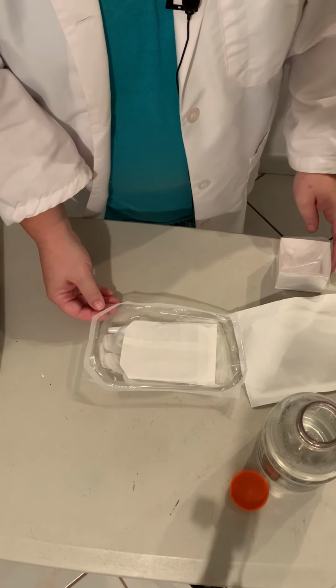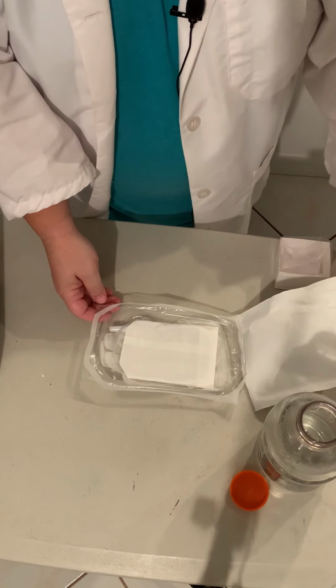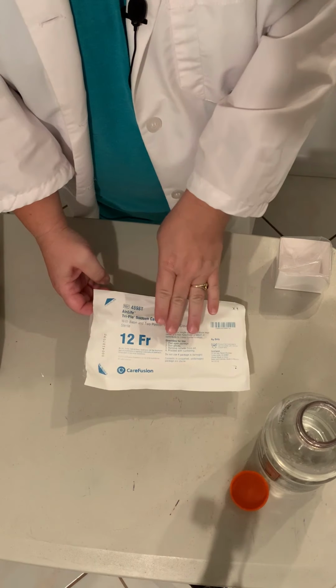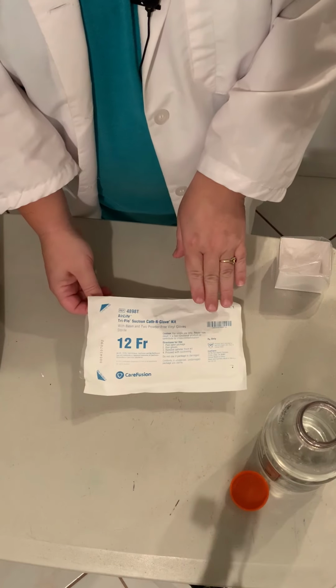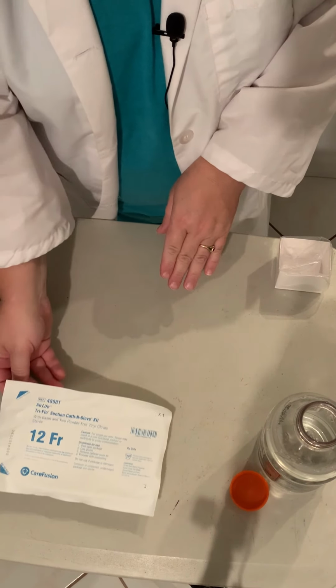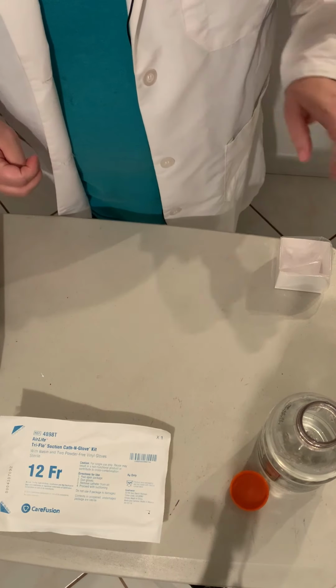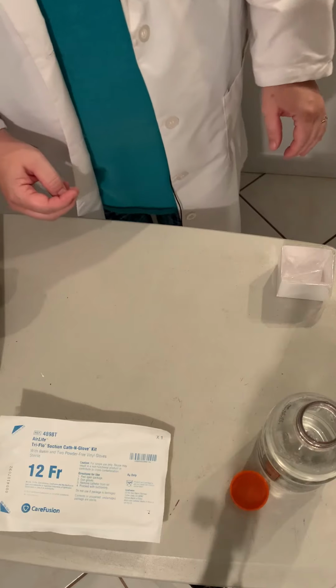Okay, if we're going to use the gloves inside, then we're going to shut our sterile kit again. If we are going to use a separate pair of gloves, then we want to leave it open and I just push it back to the back of the table. So, all right, we've got our box right there.